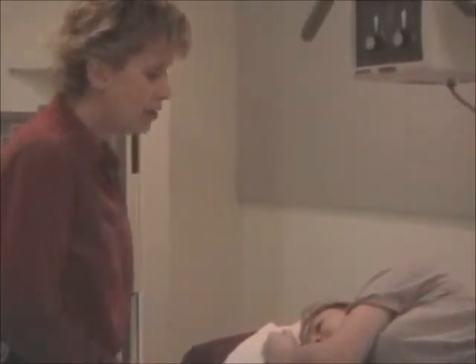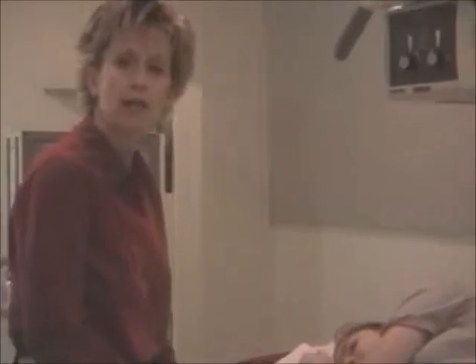We're going to move on now to a stomach exam, and since our patient's in a right lateral position, we might as well position for a right lateral. Again, I'm going to demonstrate them not in any set order. If your patient is left in a supine, AP position, you would start with your APs first. If they were left in a prone position, start with your PAs first.